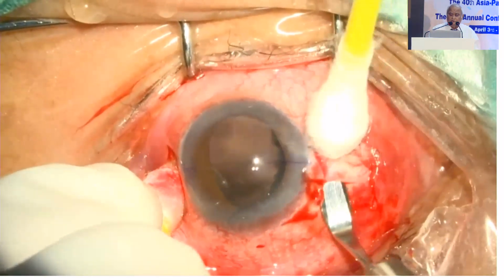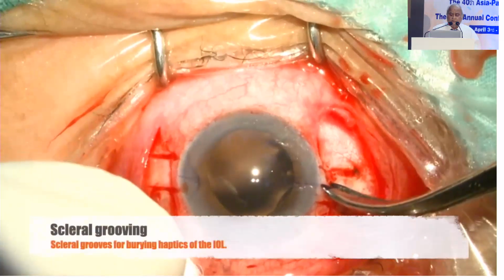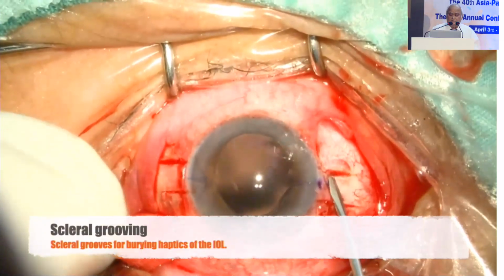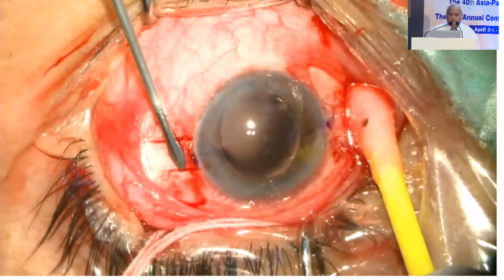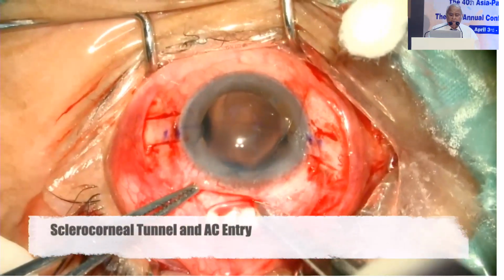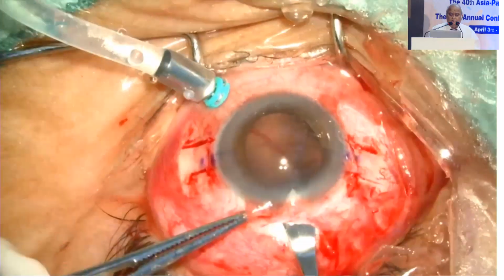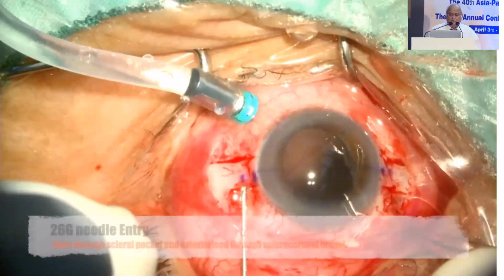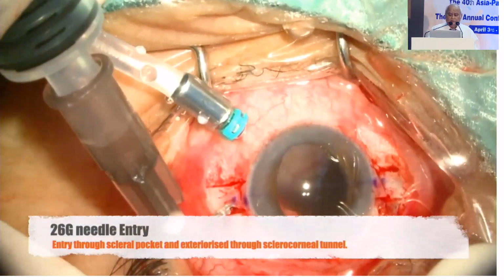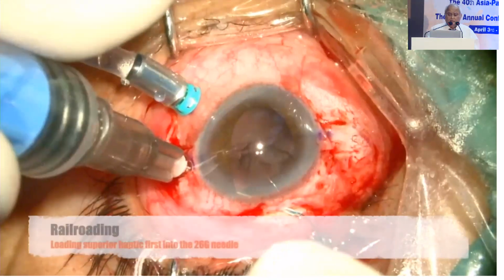These two flaps are made on both the sides, and after making the flaps you make an opening into the flap wall that you have made, and after doing a frown incision you can see the vitrectomy was done, pars plana vitrectomy was done. It's already there. It should remain over there.